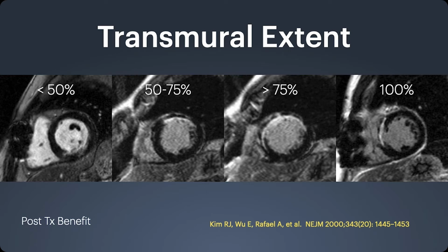If the transmural extent is less than 50%, then there's a very good likelihood that the patient will benefit from revascularization. In fact, they showed that if the infarct is less than 50% of the wall thickness, then the majority of those patients will demonstrate recovery post-intervention.